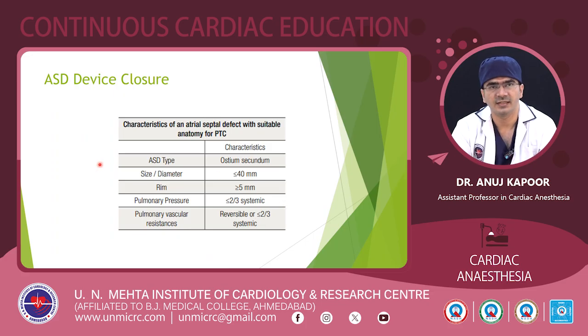Now these are the criteria for ASD device closure. Usually for device closure, an ostium secundum ASD would be preferable or easier to accomplish. The size of the defect should be less than 4 cm. All the rims should be more than 5 mm, and the pulmonary pressures should be less than 2/3 of the systemic pressure, and the pulmonary vascular resistance should be less than 2/3 of the systemic vascular resistance.